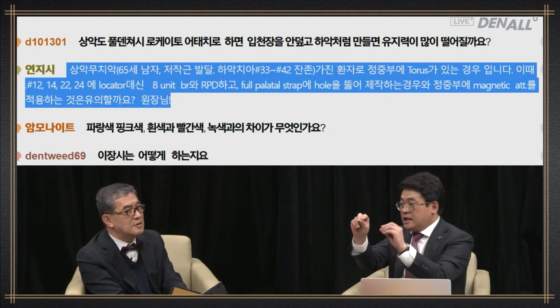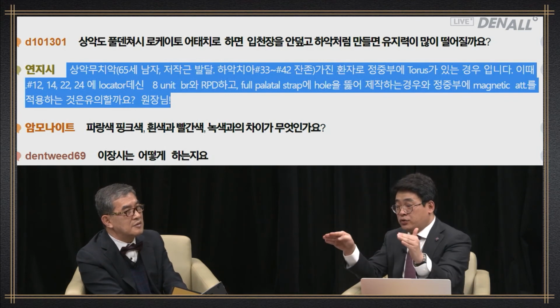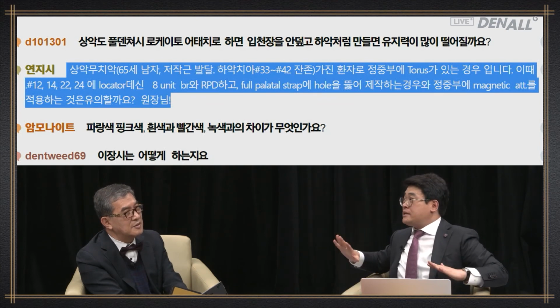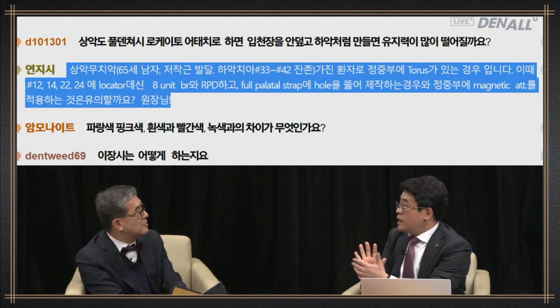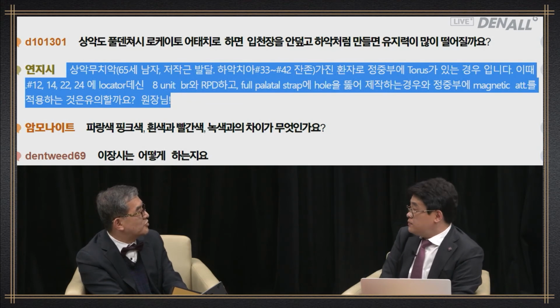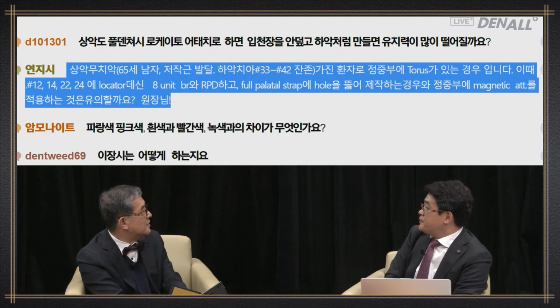In the case of U-shape, everything is in the anterior side, so the posterior side becomes longer. In order to disperse the occlusal force, you need to cover the palatal side long term. Full coverage is good long term.